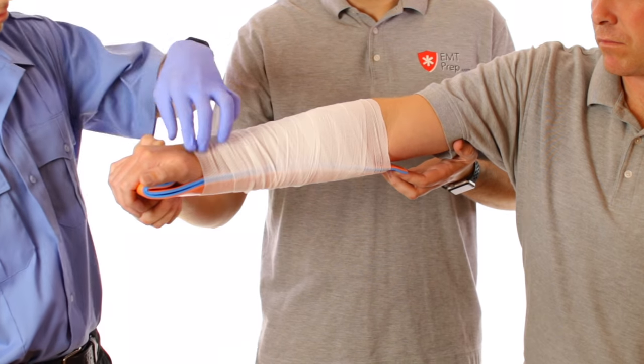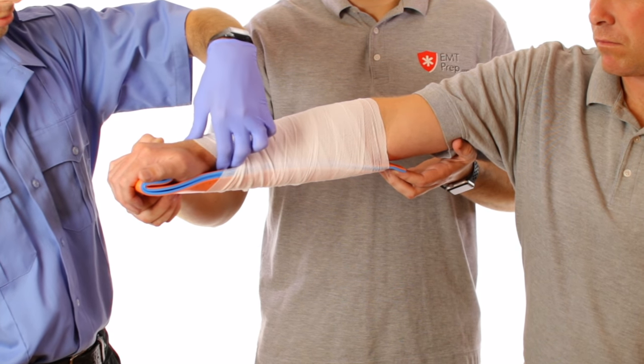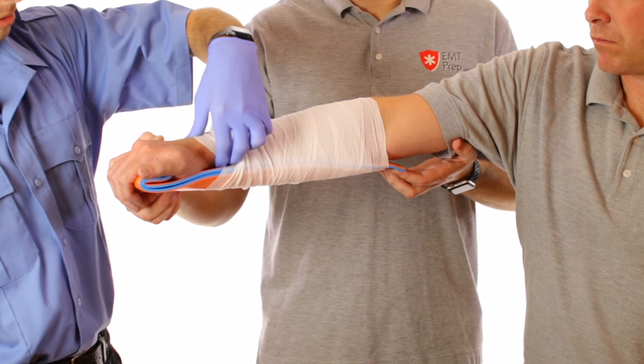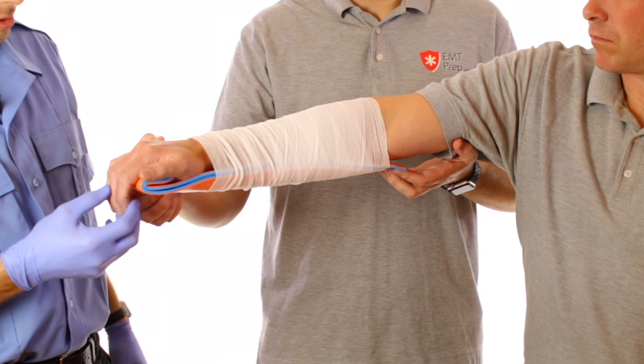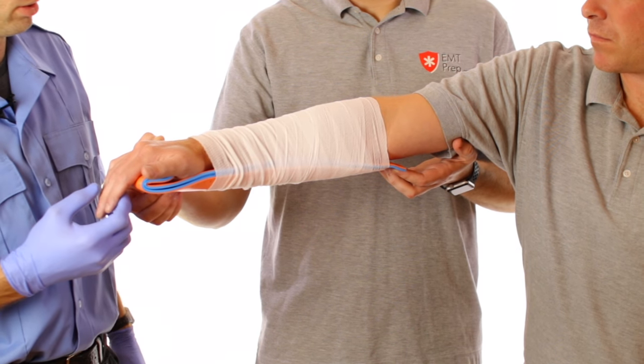Remember to check for circulation, motor ability, and sensation after the intervention. I have a radial pulse. Can you wiggle your fingers? Can you feel me touching your fingers? Yes.